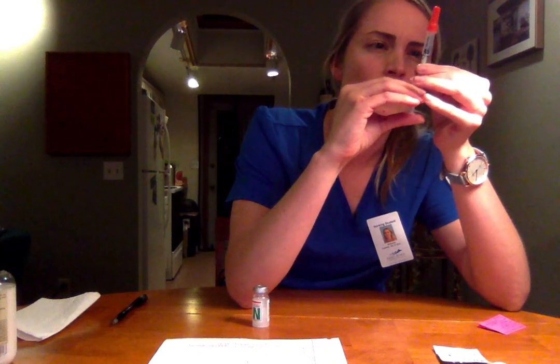So that is the third mark down from the 20. Okay, so I have it on the third mark down, and I'm going to remove the cap.